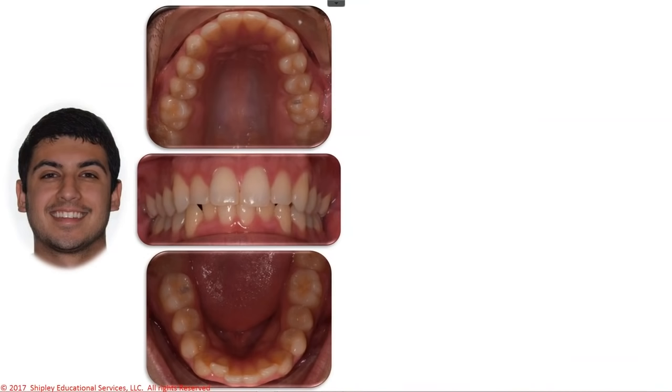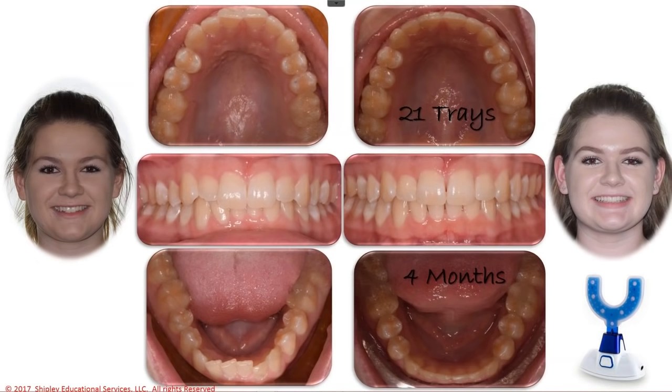This gentleman is out of the country, and I should mention on this last patient, I saw her for 4 treatment visits. So my treatment visits would be the day that we delivered the retainers to the day we took the attachments off. So that would be delivery day, a visit a month later, a visit a month later, and then 1 month later we took the attachments off. So that would be 4 treatment visits. Early on, I was seeing these vibration patients that we were changing the trays every 5 days, pretty regular every month. Now I feel very comfortable stretching those patients out 2 to 3 months on the recalls.